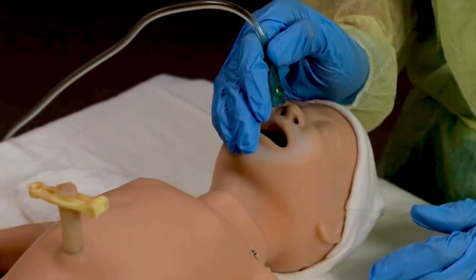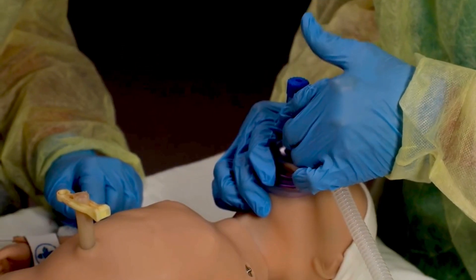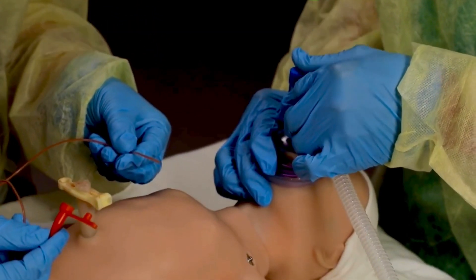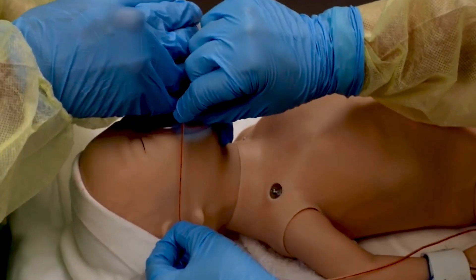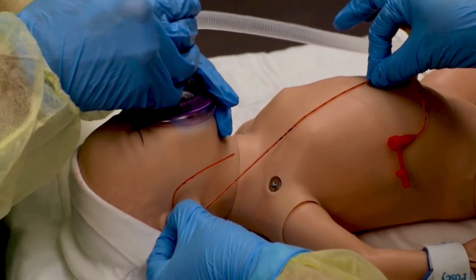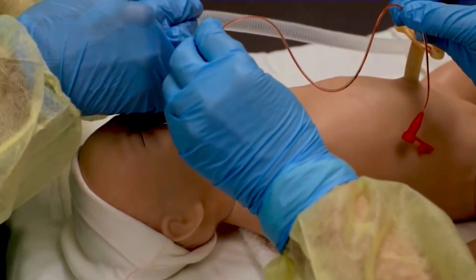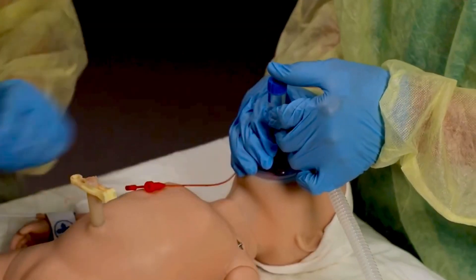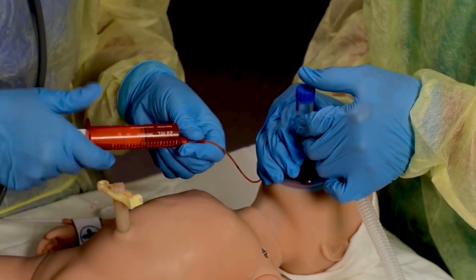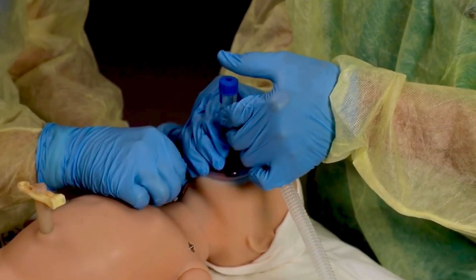You may also deliver free flow oxygen with oxygen tubing or an oxygen face mask. If a newborn requires CPAP or PPV with a mask for longer than several minutes, insert an orogastric tube to decompress the stomach. Measure the insertion depth from the bridge of the nose to the earlobe and from the earlobe to a point halfway between the xiphoid process and the umbilicus. Note the centimeter mark at that place on the tube. Insert the tube through the mouth, resume ventilation, attach a syringe and remove the air and gastric contents. Remove the syringe and leave the end of the tube open to provide a vent for air entering the stomach. Tape the tube to the baby's cheek and reassess PPV to ensure chest movement.